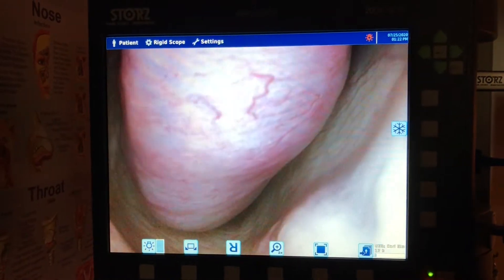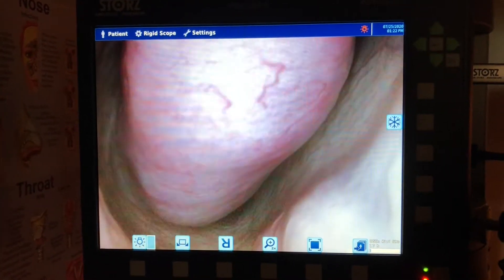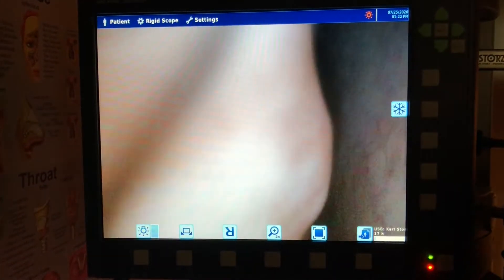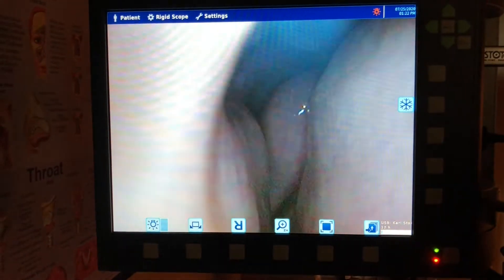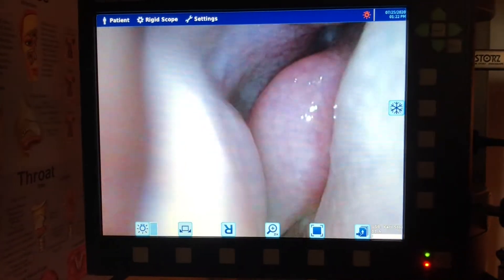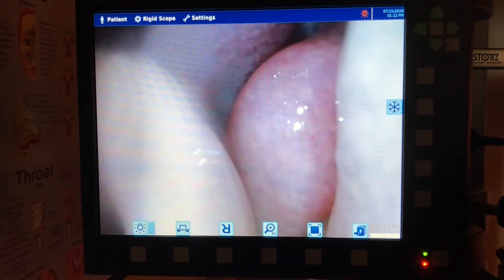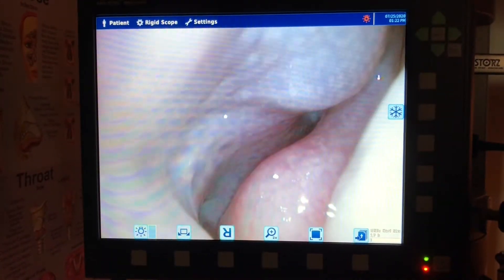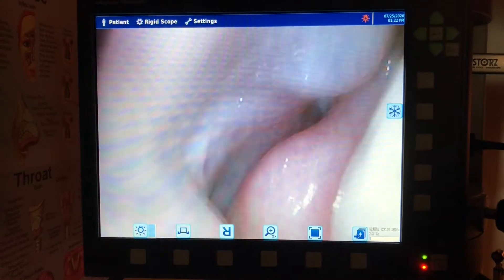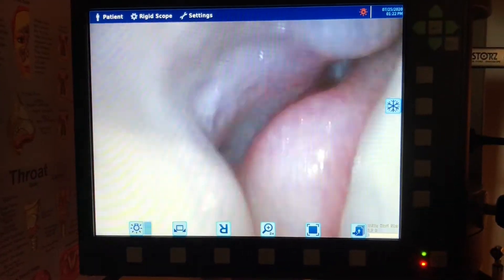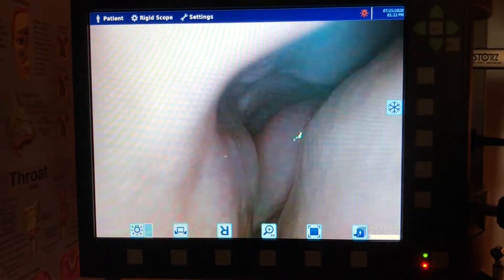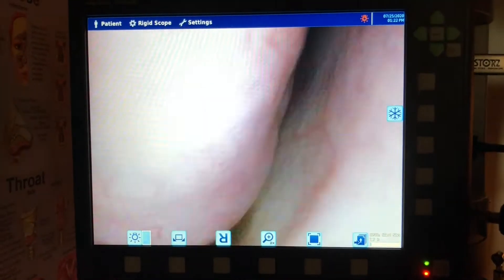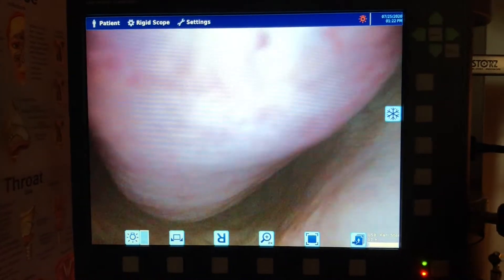What we're looking at right there is one of the turbinates — that's the inferior, or lower, turbinate. Over here is the middle turbinate, and she's got a very nice lining of the middle turbinate and inferior turbinates. Now we're going to go all the way to the back of the nose.